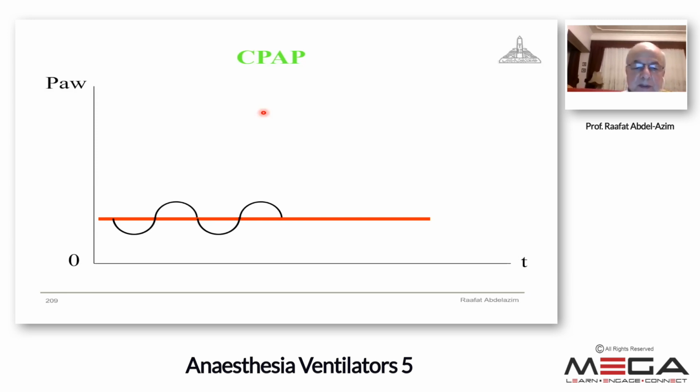If the patient is breathing spontaneously, we can apply pressure all the time by partially closing the APL valve. For spontaneous breathing using the reservoir bag and the APL valve, we will adjust it to be partially closed to give a value more than 0, and this is a continuous pressure during the whole respiratory cycle. The spontaneous breathing will be slightly below the set value for inspiration and slightly above the preset value during expiration.